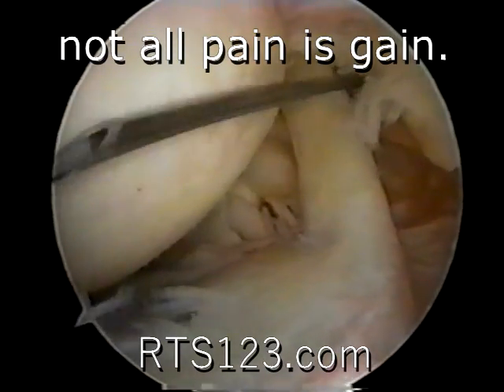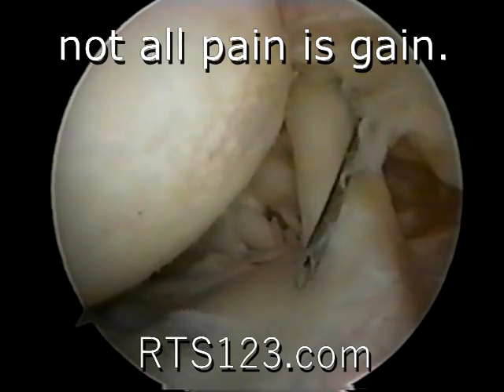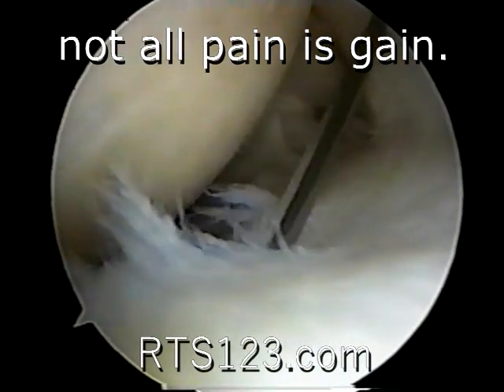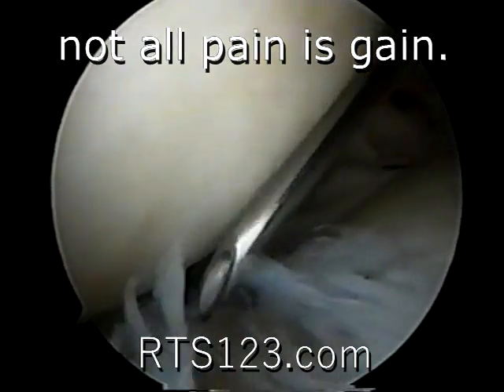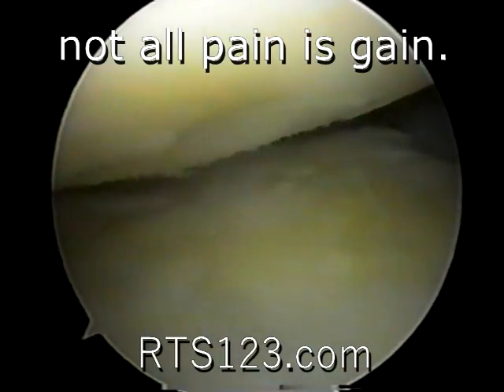This needle's coming in the front of your shoulder just above the biceps tendon. This is the biceps right here. It attaches to the top of the glenoid via this big labrum or cartilage, which is quite irregular and ragged here. You've got a lot of redundancy in this cartilage that's sort of being frayed here. Now this is your humeral head to the left. The glenoid or the socket is down here below.